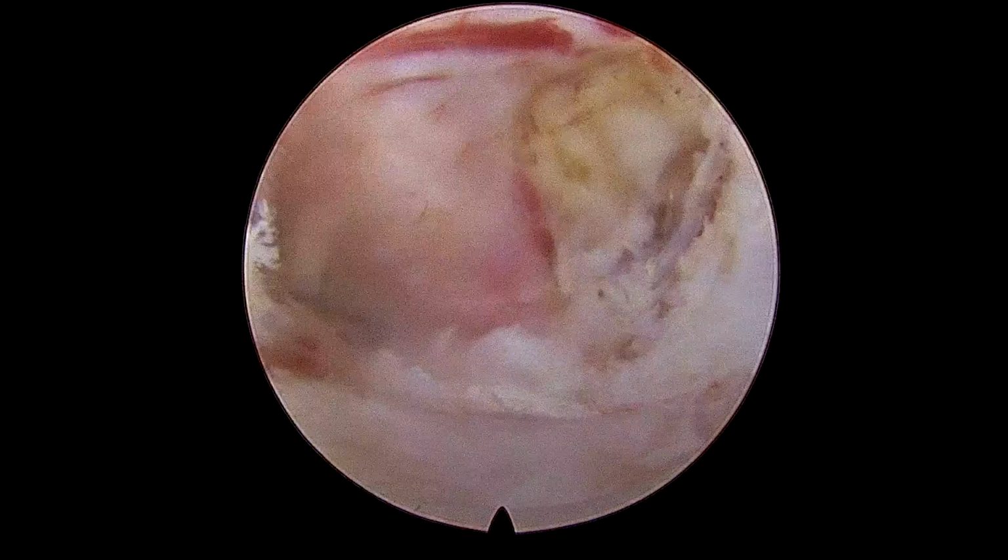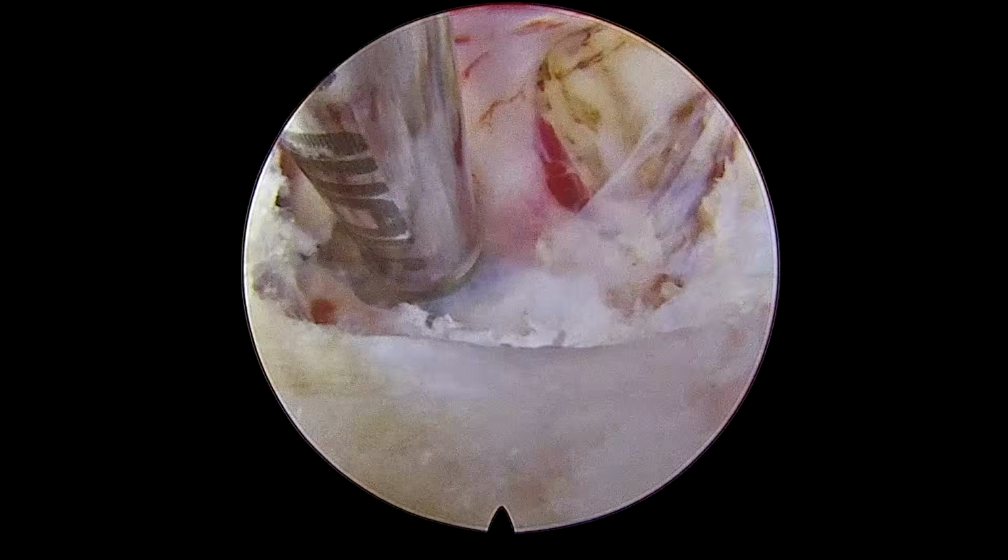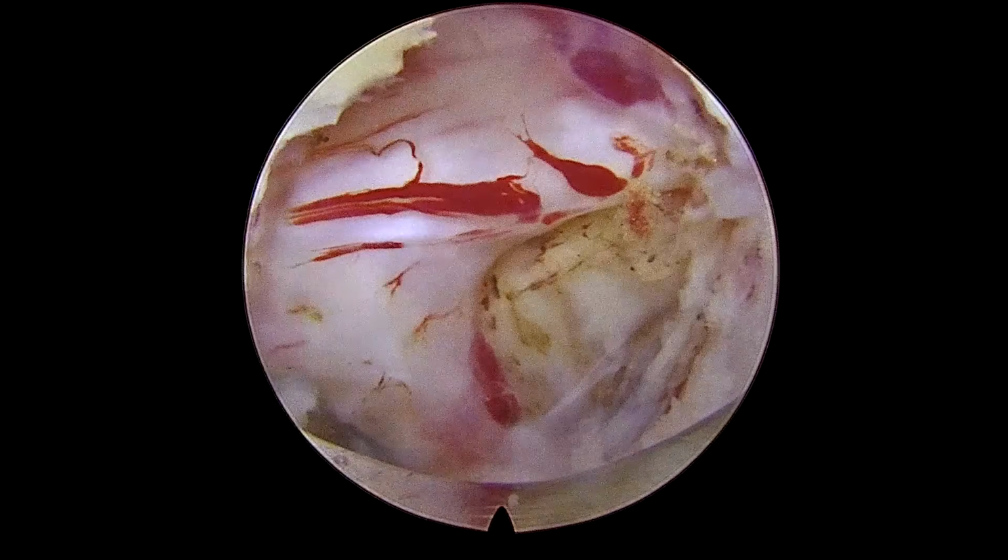So now we'll prepare for the discectomy. Now everything is clear. We have delineated the root in its entire length. You can see the axilla clearly, you can see the shoulder clearly. So now just prepare for the discectomy.